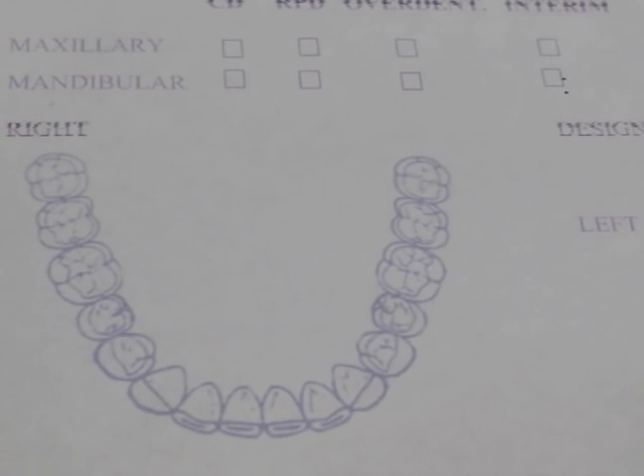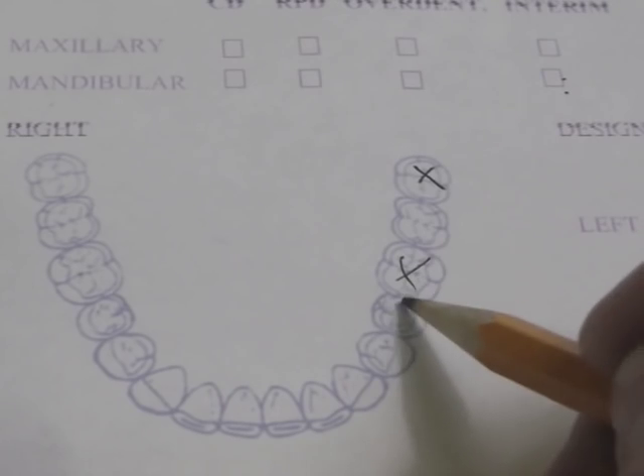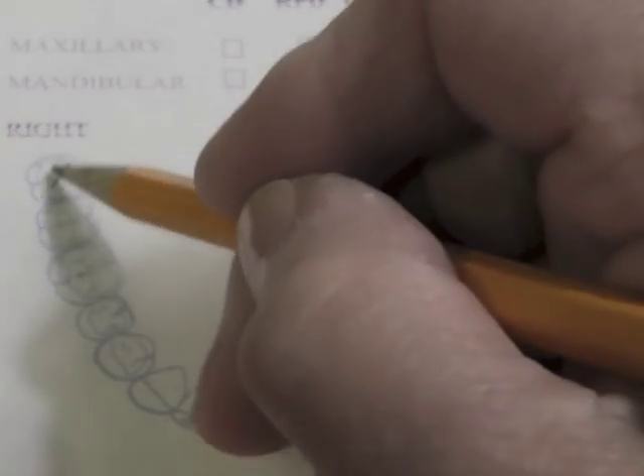Let's go ahead and place our design on our tentative design sheet, which we will do every time we have a treatment plan. The first thing I like to do is cross off all the teeth that we're not going to use in our design.